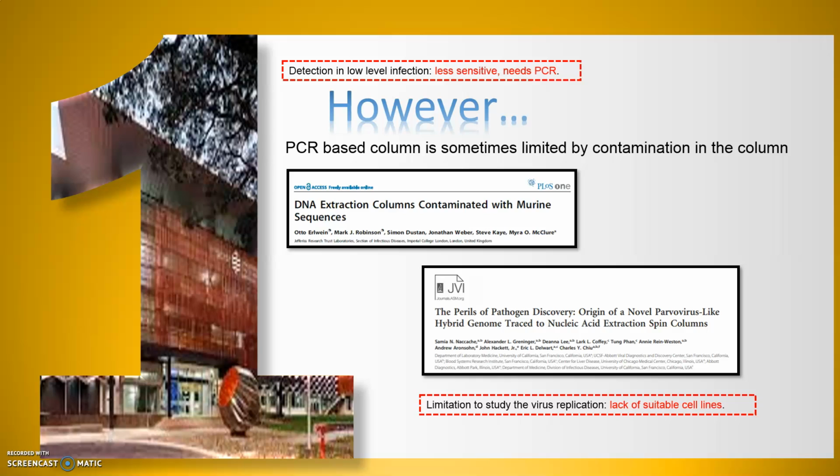The growth of crustacean viruses in C6/36 in the previous studies was still questionable and tends to be negative. Therefore, it is crucial to examine insect cell culture as an alternative to mosquito cell culture. Another insect cell culture that has been widely used to study viruses is derived from Lepidoptera, Spodoptera frugiperda ovarian tissues, or SF9.